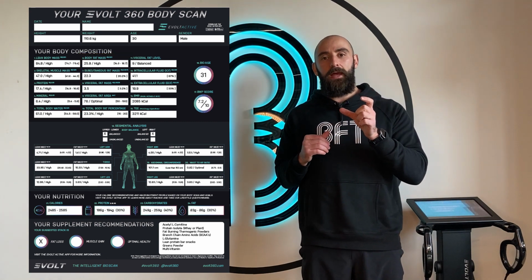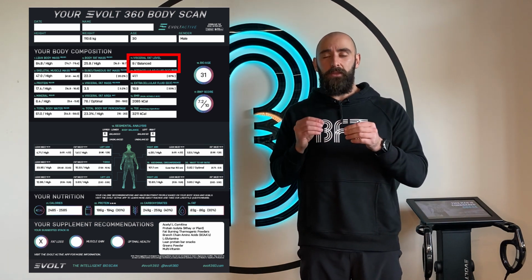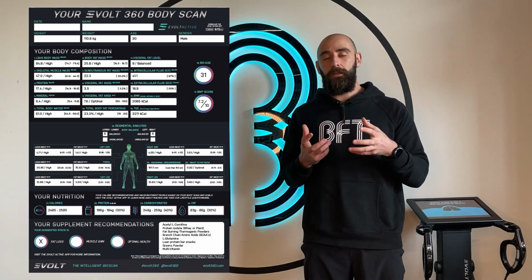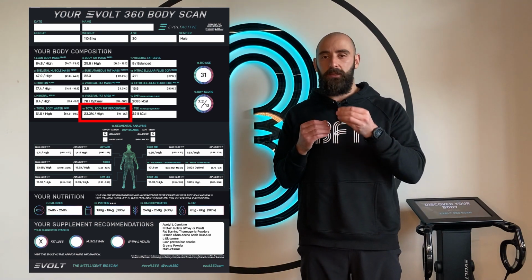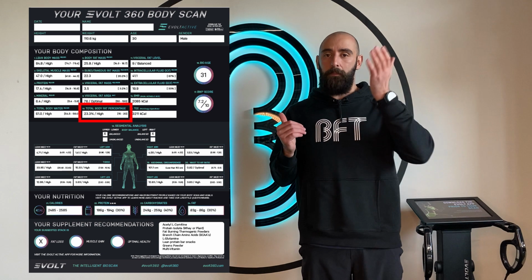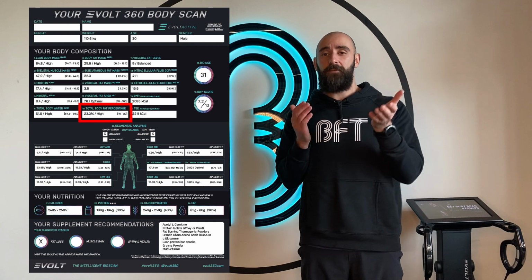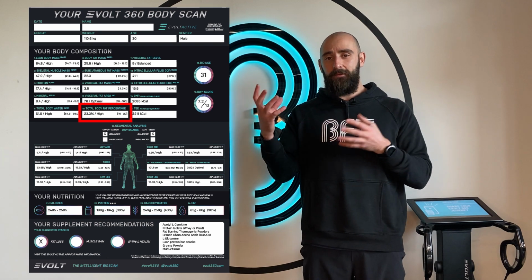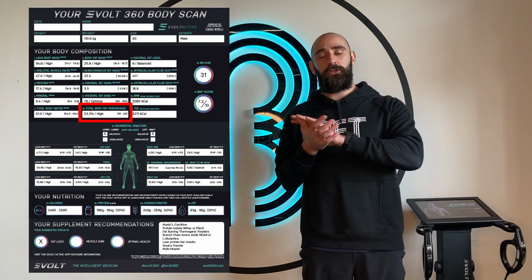Now the visceral has a scale of 1 to 20 with anywhere from 1 to 9 being a balanced finding. And then with your subcutaneous fat, that is going to be very dependent on your individual circumstances. Now fat is very commonly referred to or broken down into a body fat percentage. Now the body fat percentage is just a percentage of fat within your body to everything else. Now, if you were to lose body fat and keep your muscle at the level it's at, what you will have is a lower body fat percentage. If you were to lose fat and muscle at the same rate, your body fat percentage will stay the same. And should you maintain fat and increase your muscle mass, your body fat percentage will actually decrease again, because that fat is a percentage to everything else in the body.